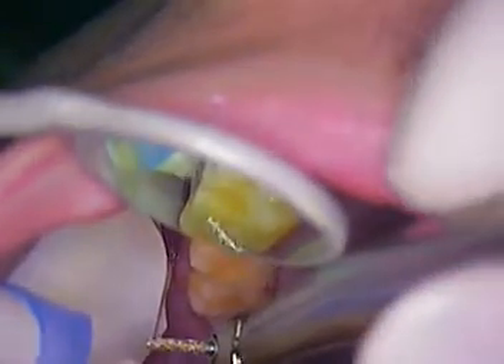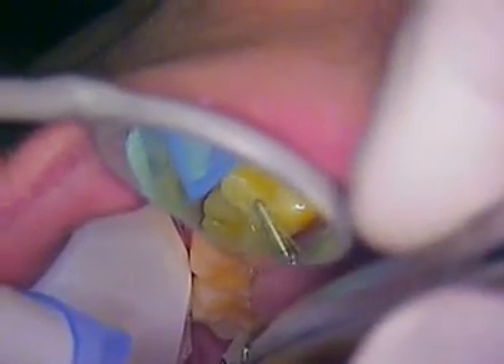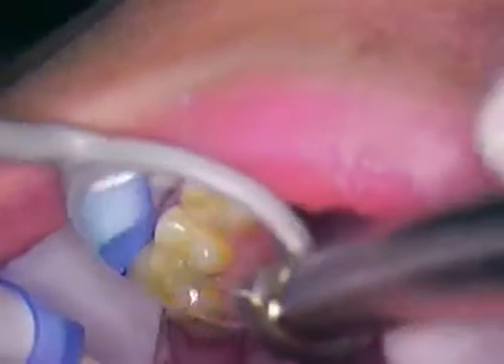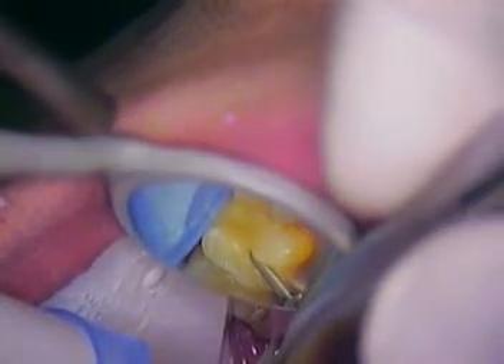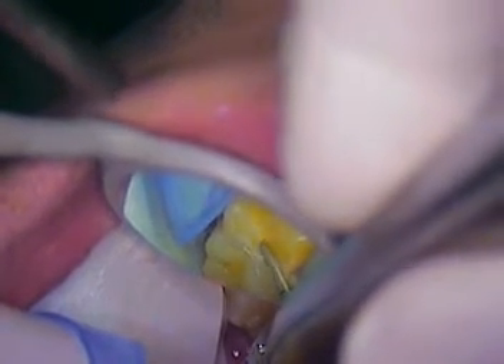We're going to start off with an occlusal reduction first. I'm using about a 1.5 to 1.75 millimeter diameter reduction. I'll take it down to the depth of the bur, the diameter of the bur, and we'll stay in the three-plane preparation. There might be some viewers out there that are dental students — it's good to watch this if you're a junior and you get an idea on tooth preparation design. I like to shoot for the three planes.